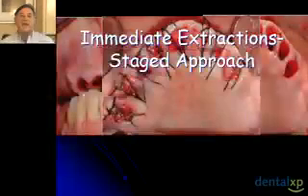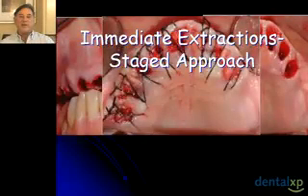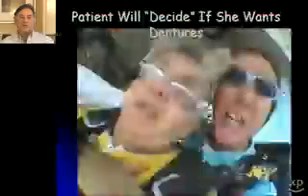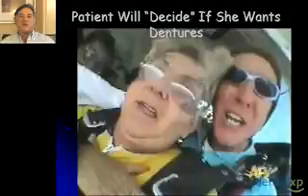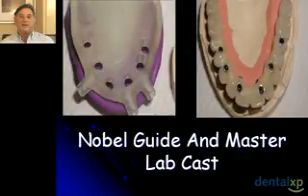We extracted the teeth, performed some preservation of the sockets, and I would call that an immediate extraction with a staged approach because she went into an immediate denture, and we were not planning on doing any implant therapy at this moment in time. She actually was the patient in this particular video. She decided that she wanted to have an implant-supported restoration. We then put her into the CT scanning. We planned 6 implants for her case.